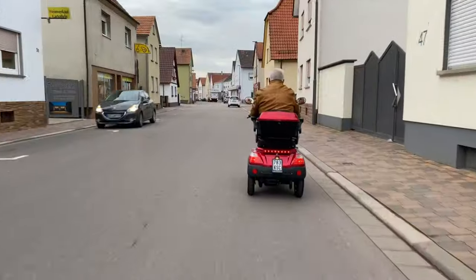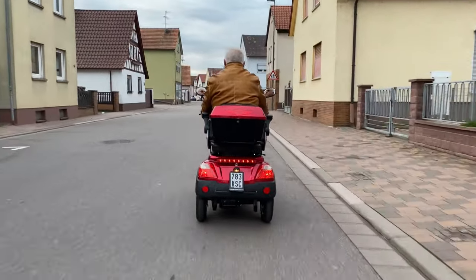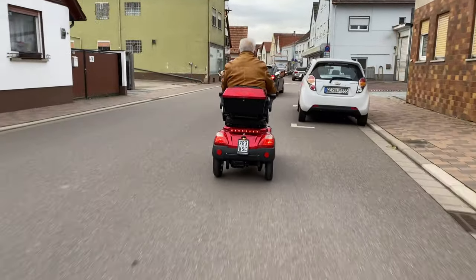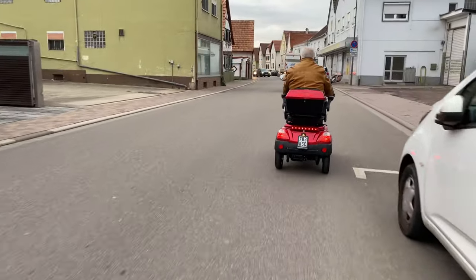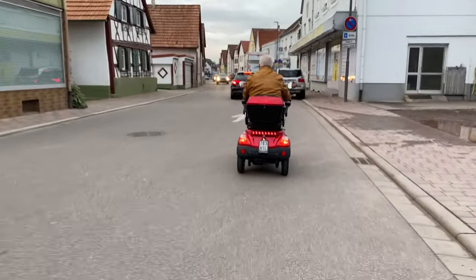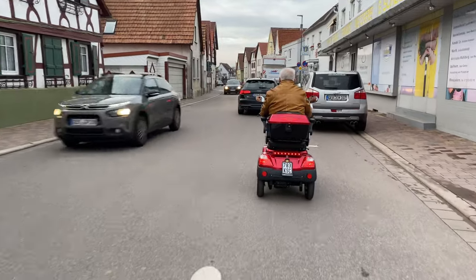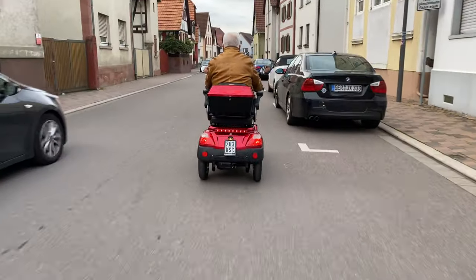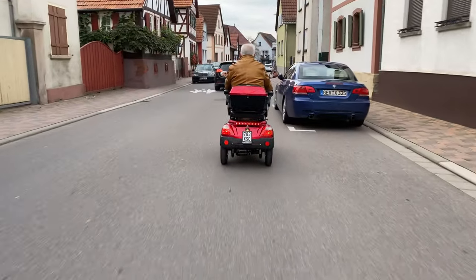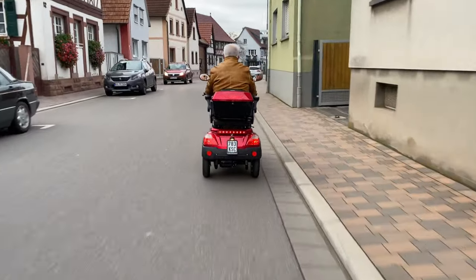Speaking of the socket, what does the electricity consumption cost? The Luxon has a consumption of 37 watt-hours per kilometer. So if you drive 100 kilometers, you will consume 3.7 kilowatt-hours. And if you pay, for example, 30 cents for one kilowatt-hour, the costs for 100 kilometers are around 1 euro and 11 cents.